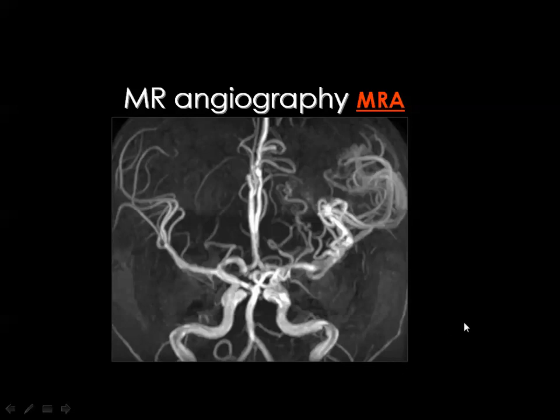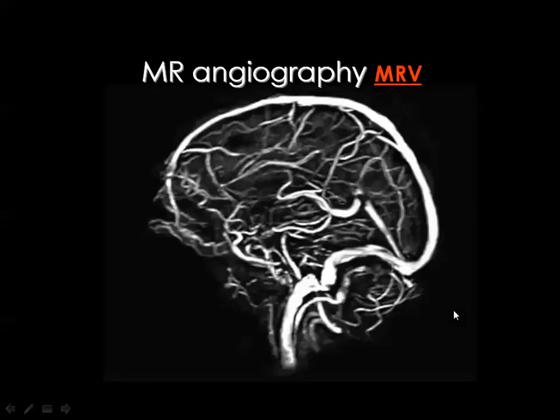Then I will give you some examples, and also you can image the veins, the dural sinuses and the internal cerebral veins, for example, and this is known as MR venography, and this is applicable anywhere in the body for the portal vein, for example, for the lower and the upper limb veins.